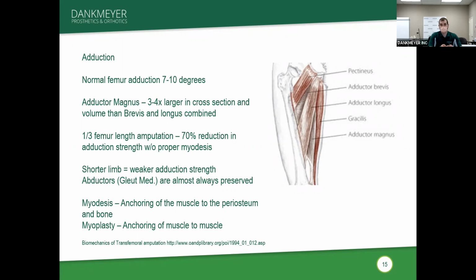This can actually create quite a few problems for us, prosthetically speaking, because if it's not attached to the bone, it's able to move around and it ends up pulling the tissue. This can cause many difficulties when fitting a residual limb, because then you have this moving target. The shape of the limb changes between firing of a muscle and relaxing.